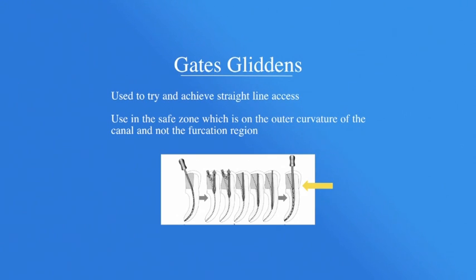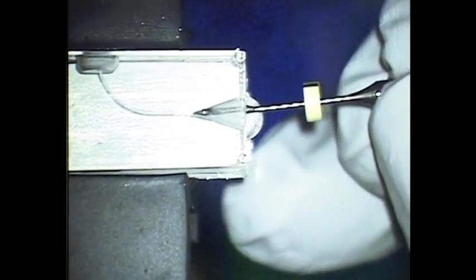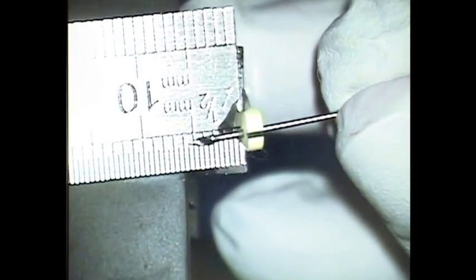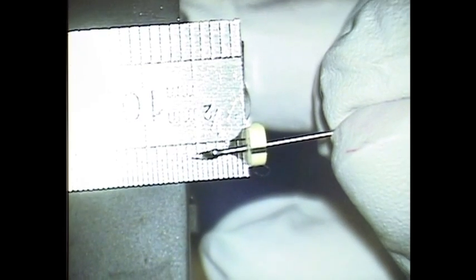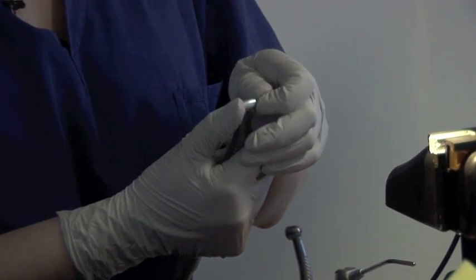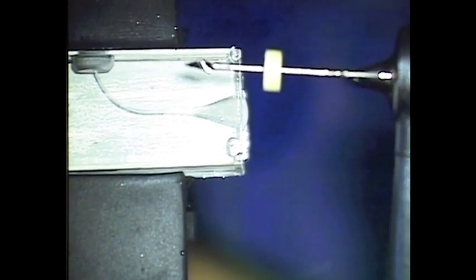I'm going to take a Gates Glidden, and this is a number three Gates Glidden which you can see from the banding. Place that into the canal — we must only use the Gates Gliddens in the coronal third of the canal. I've got a stop on here and I need to measure where that goes to. That is measuring at 5.5 millimetres, and I'm going to add on approximately 2 millimetres onto that, so that will make it 7.5. I'm going to place this in my handpiece in a latch grip — you must check that it goes in and is locked into the handpiece, and also check that it actually rotates properly before you introduce it into the canal.